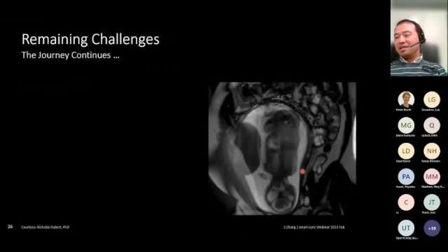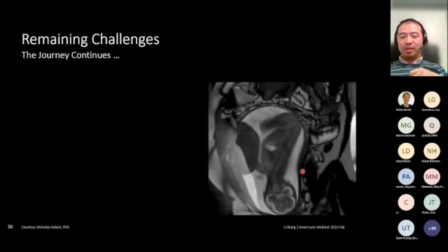This is a dancing baby movie I borrowed from Nick and Luis.